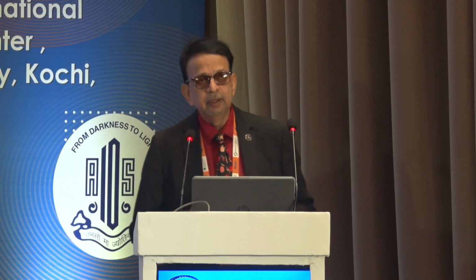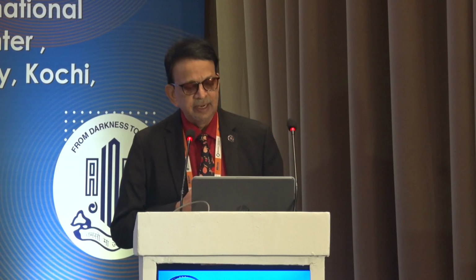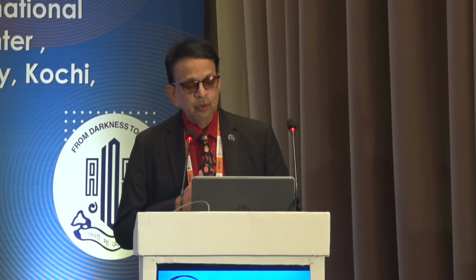So just to show you another patient, you can see here how the cataract is. I'm using femto laser assisted cataract surgery. The parameters are there for all of you to see. And again, just to show you the different parameters, this is a white cataract. Many people think that the laser will not be able to penetrate. Don't underestimate the versatility of this laser or the femto machines. It can, as long as the OCT is able to recognize. You can see this is a white cataract, and many times, if you do a white cataract capsulorhexis, you end up with an Argentinian flag sign.